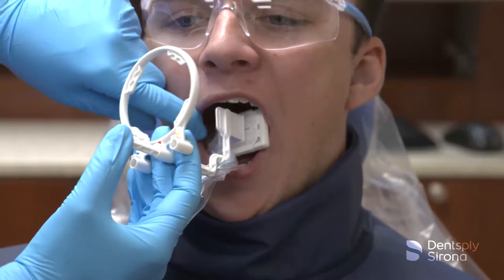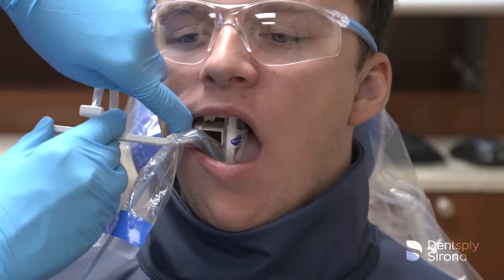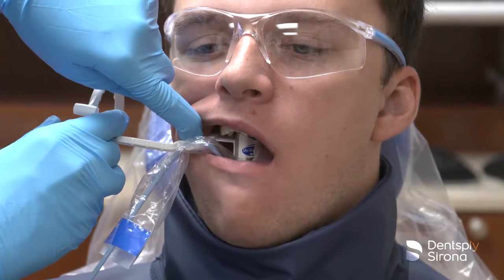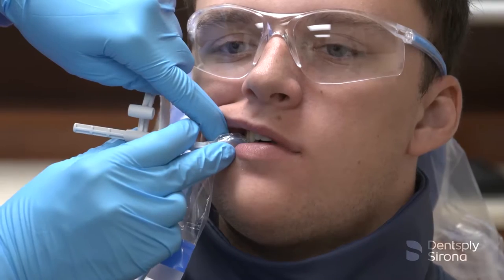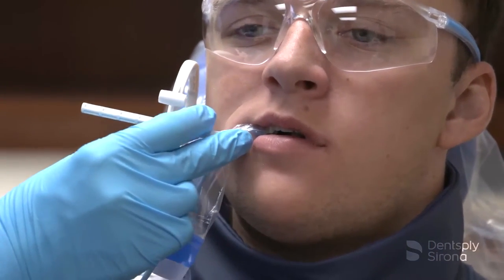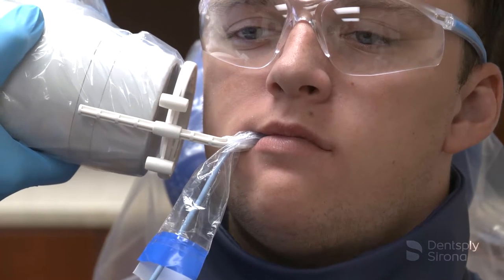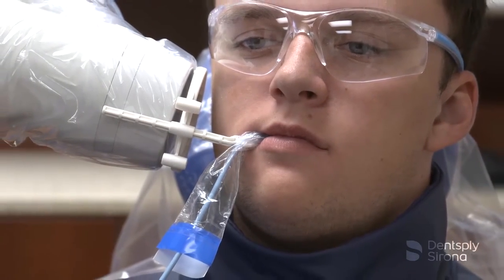Similar to the premolar bitewing, the central ray must be perpendicular to the image receptor when placing the molar bitewing. It is essential to include the distal most portion of the second molar or third molar if present. Once the bite block is in place, slide the aiming ring down the arm close to the patient's face. Align the tube head of the x-ray unit in a close approximation to the aiming ring and center it. The x-ray image is now ready to be captured.